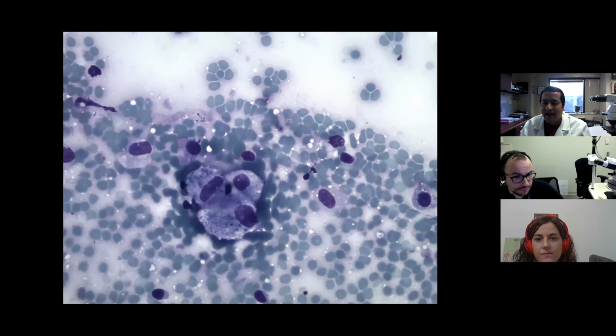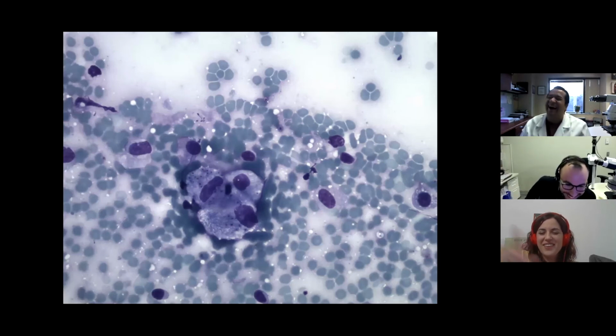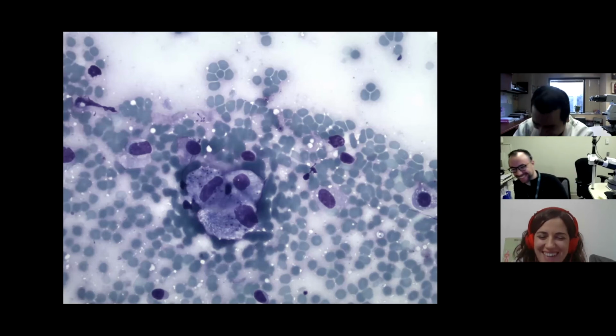All right, and we're back to your favorites. He threw us some biopsies, but they say they are not guessing the biopsies needed. Let's go back to cytology. Let's go.